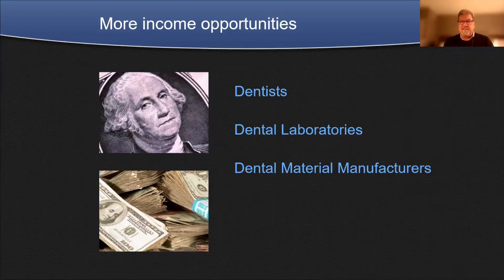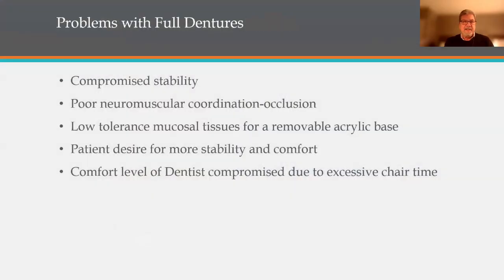More income opportunities for dentists, dental laboratories, dental material manufacturers. So yeah, there's a lot of growth opportunity out there on the removable side of the market. Some of the problems we've seen with full dentures in the past are compromised stability, poor neuromuscular coordination, bad occlusion, low tolerance from mucosal tissue on the acrylic base for sore spots, and the patient's desire for more stability and comfort. So many patients just don't wear their dentures because they're not comfortable and they can't function with it.